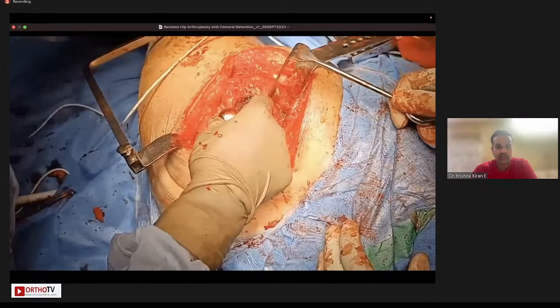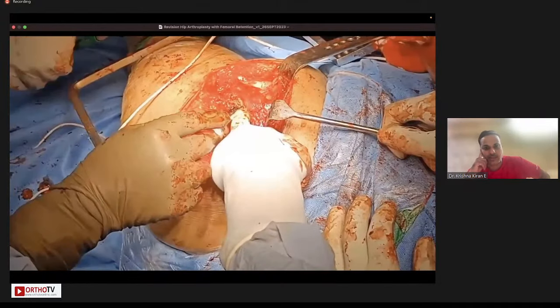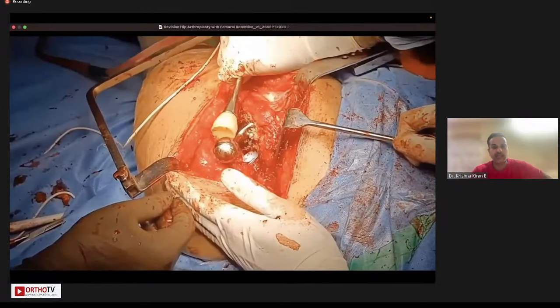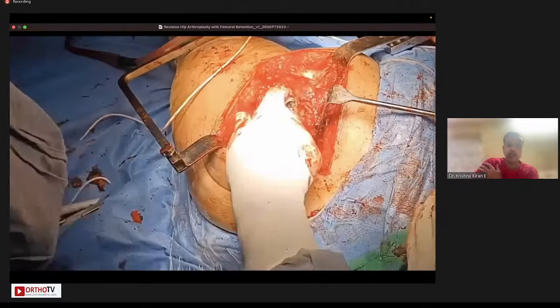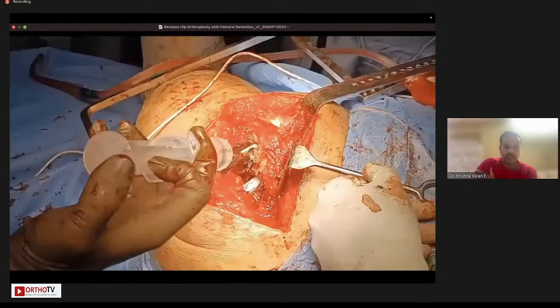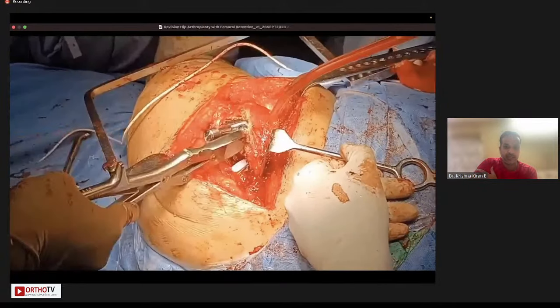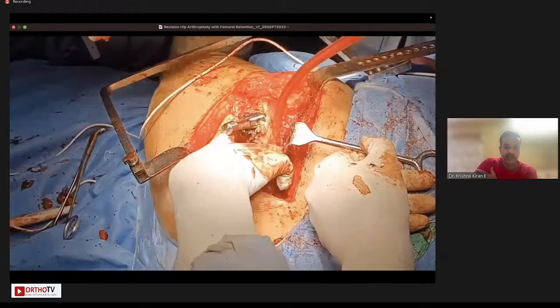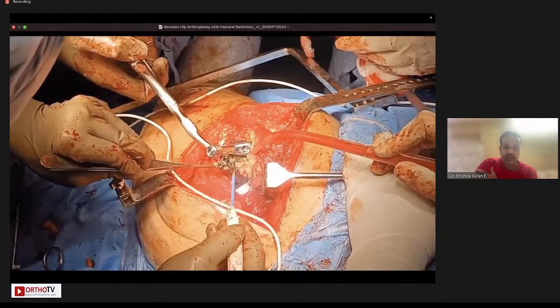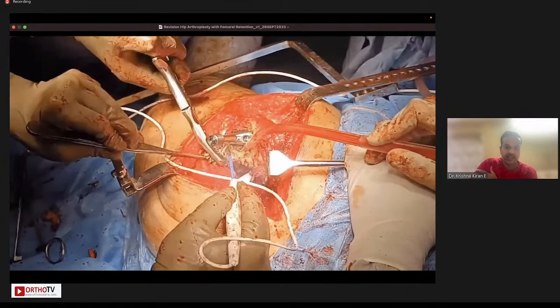Now you remove the head. So you can notice that I have not removed the head, and I've been able to do the socket without removing the head. And now you inspect the trunnion for any damage. And we typically use what are called the Goldberg criteria to see if there is any macroscopic damage to the trunnion and what is the extent of this damage. And then we assess the stability of the femoral component and see what is the extent of the proximal osteolysis and whether this will require revision or it doesn't require revision. And this can be done at the initial stages itself.